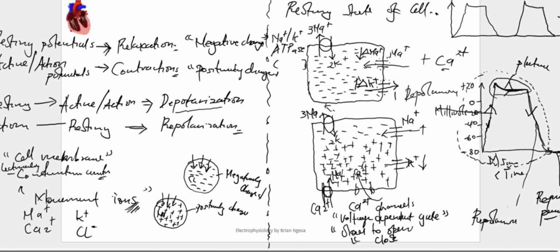Maybe to give us a clue as we continue, when you are using an electrocardiogram, the action potential is dependent on the movement of sodium, potassium and calcium. That means if you have some electrolyte imbalance or some biochemical imbalance, it might also affect the way the ECG displays its results. So that is very, very important to note.